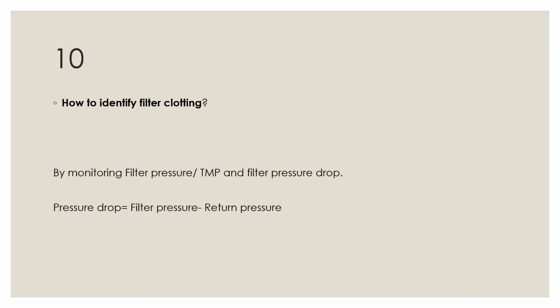How to identify filter clotting? It can be done by closely monitoring filter pressure, transmembrane pressure and filter pressure drop. Filter pressure drop can be calculated by subtracting return pressure from filter pressure.